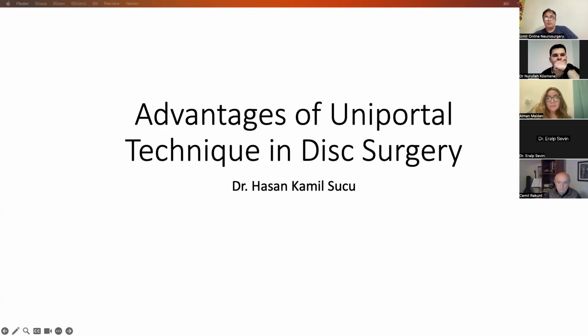Hello everyone. Today I will explain the advantages of the uniportal technique in disc surgery, comparing it to the unilateral biportal procedure. Regarding the uniportal approach, we need to mention two main subgroups, transforaminal and interlaminar.